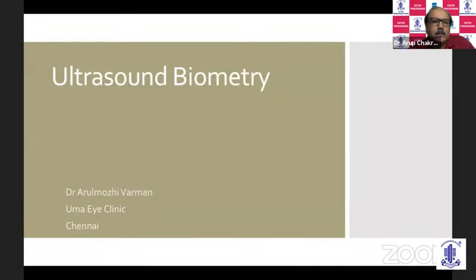Dr. Arul, sir. Thank you, Arup, for inviting me to be here. My talk is going to be on ultrasound biometry, probably the oldest instrument that we use to calculate IOL power next to the keratometer. It still finds its use today in spite of having excellent optical biometers.